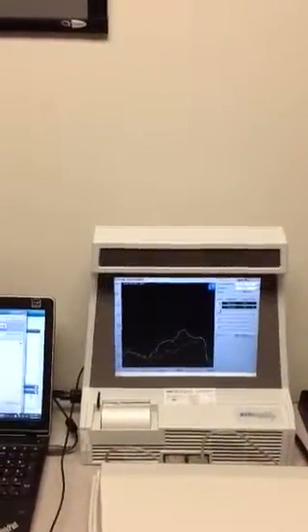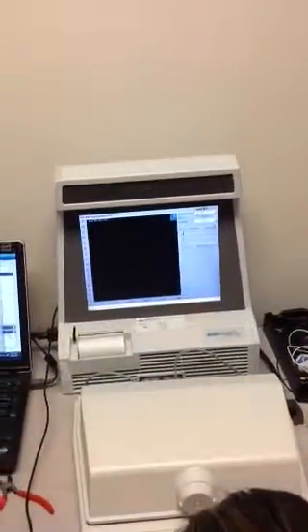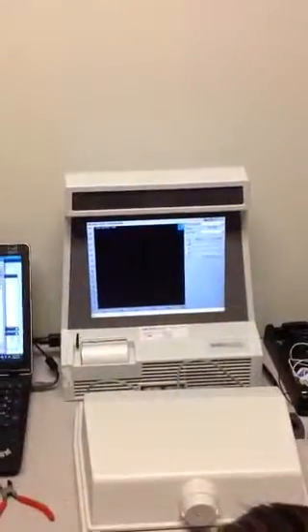So now, I want to see if the noise reduction is working. So just to verify noise reduction by itself, I'm going to force it back to an omnidirectional microphone and then start adjusting the noise control settings by themselves. So in this VeriFit, you go back to the test menu, on ear measurements, and then select noise reduction. So in the noise reduction, you do not need the rear speaker, so you can unplug that, because there will be nothing presented from behind her.